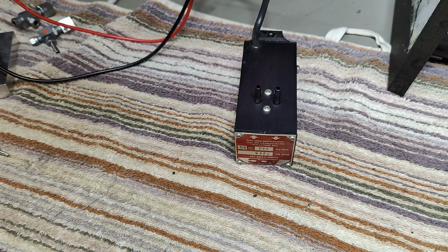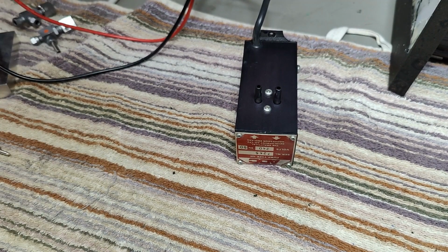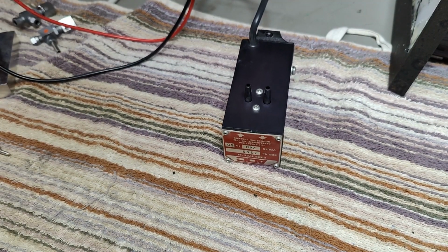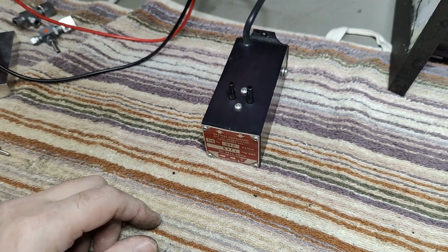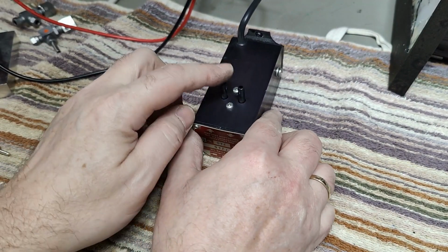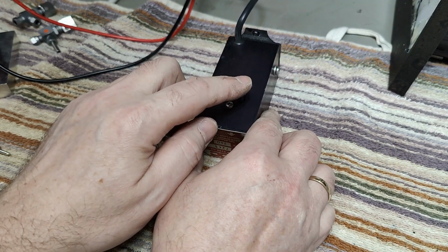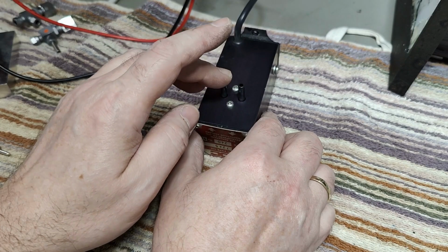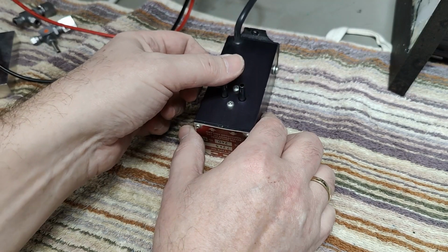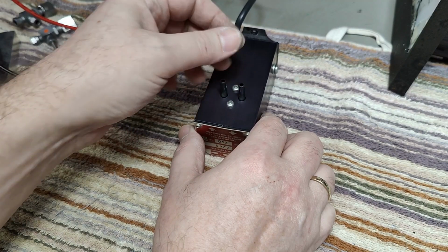I'm a little bit curious about those pumps. So I'm now trying to... Oh, it's using almost 4 watts. Oi, look at those vibrations. It's not moving a lot of air, to be honest, just measurement air.